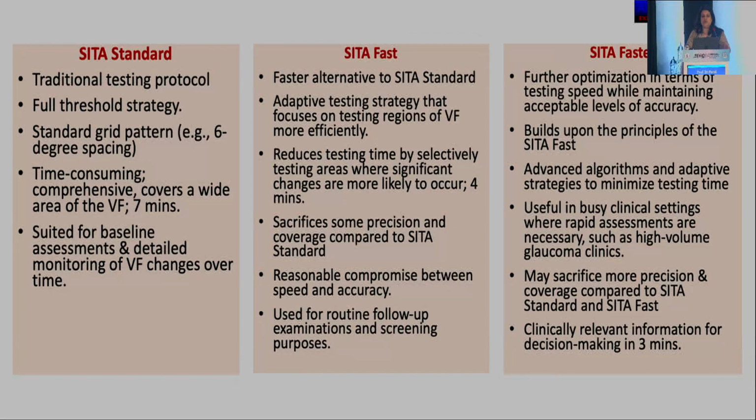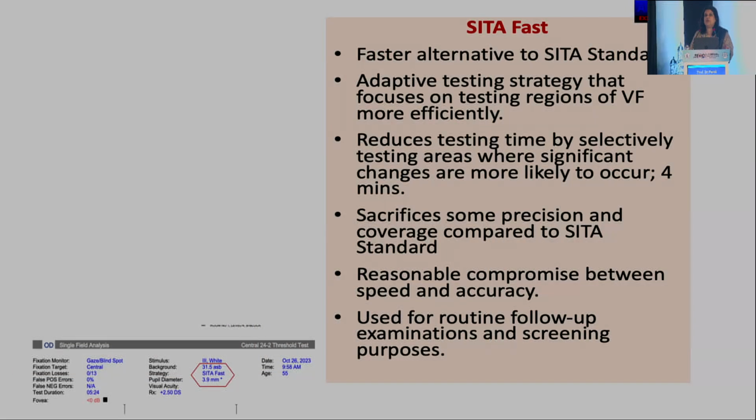Time to switch to another strategy is best when the patient is stable, rather than when you suspect there is some amount of progression, because then you really need to stick to the primary strategy that you're using.